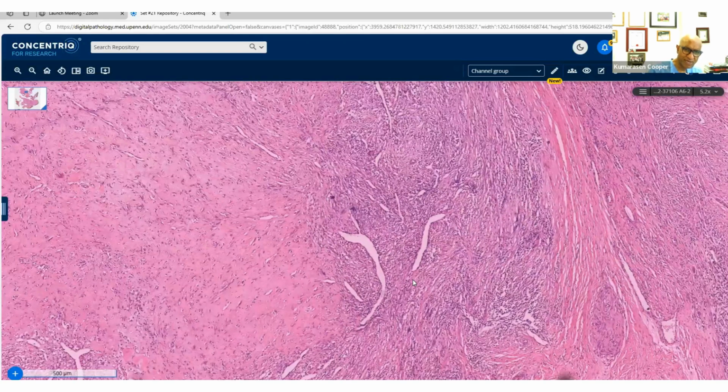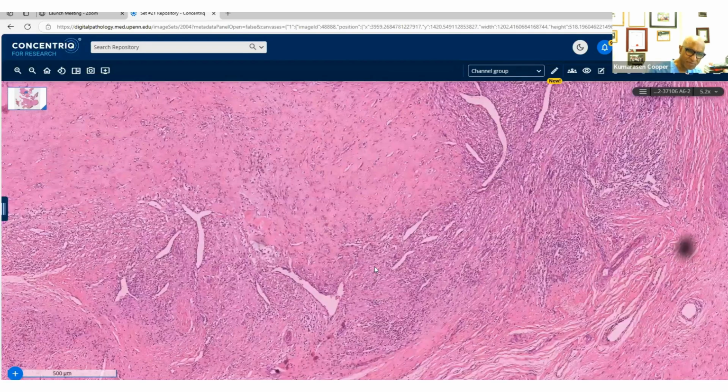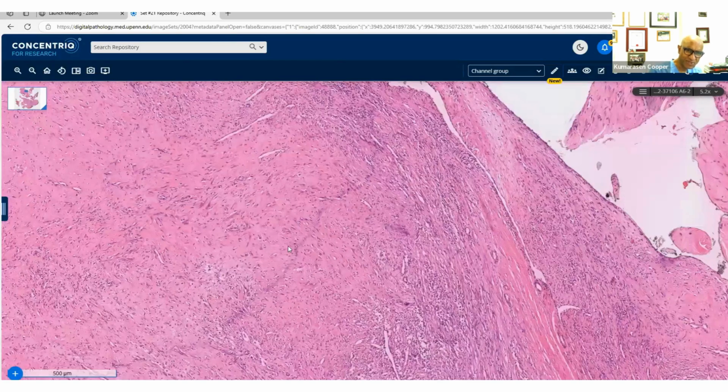Now, I'm happy also, Carla, that you mentioned both benign tumors, because this tumor is benign, and I'm happy that your differential thinking is along benign lines. So the actin was negative, CD34 negative, and the STAT6 negative. So we got those covered. Any other thoughts?